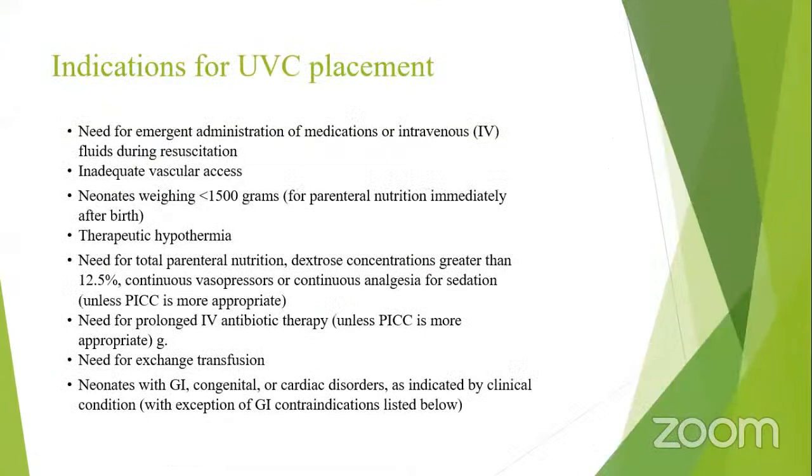Indications for UVC placement: need for emergent administration of medications or intravenous fluid during resuscitation. Marwa, in this one, they call it urgent, and usually it's done with aseptic technique, and usually it's in the resuscitation room. Okay, go ahead.